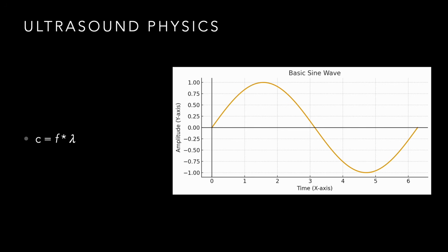One of the main assumptions with ultrasound is that what gets sent out is what gets sent back. So if I send something at, let's say, 2 megahertz, I'm going to hear it back at 2 megahertz. But the reality is we don't always get our signal back at 2 megahertz on the nose. It may be something slightly different. And when we see this slight variation in the frequency that's returned, this is where we get the basis and the fundamentals for Doppler ultrasound. We're going to measure that delta and look at that.